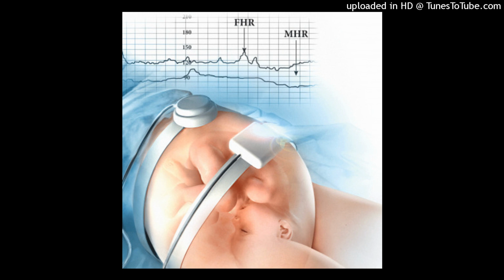Benefits of fetal spiral electrodes. The benefits of FSEs are as follows: capable of accurately displaying some fetal cardiac arrhythmias when linked to electrocardiographic recorder. Accurately displays an FHR between 30 and 240 BPM. Maternal positional changes do not usually affect quality of FHR tracing.